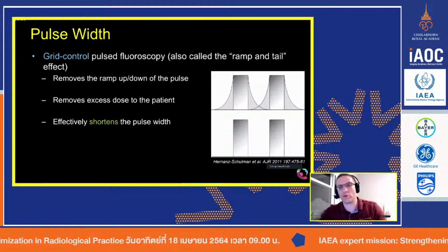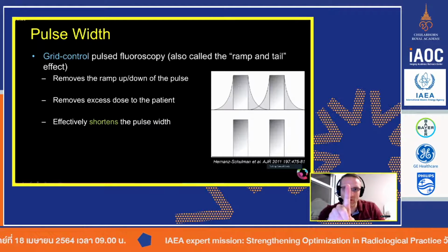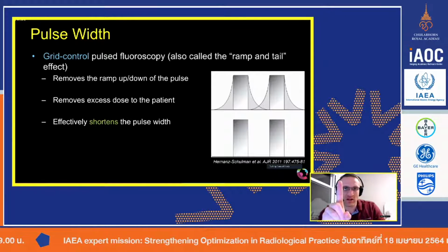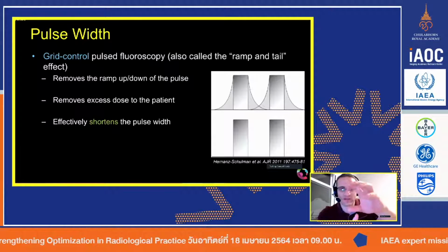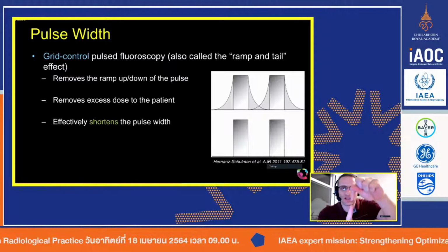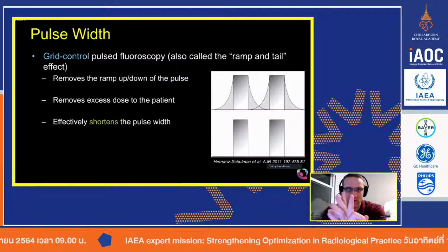But a lot of the new modern systems will have what's called a grid control, where, when you turn on the system, the cathode will turn on and stay on. So there are actually electrons boiling off constantly, but they have various magnets and other ways to keep the electrons at the cathode side. So you basically have a magnet shielding the electrons from leaving the cathode.